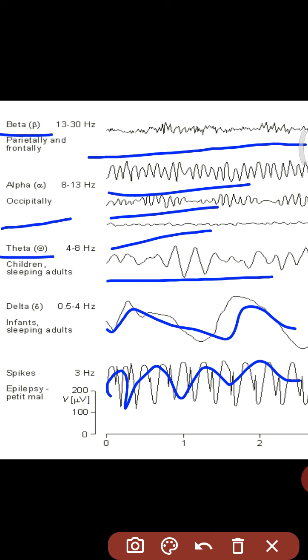Now we have spikes and waves of abnormal shapes occurring during attacks of epilepsy. The excitation or damping of electrical activity in the cortex can be due to a tumor, as a tumor presses on the neurons as well as destroys them. Oxygen deficiency due to circulatory disturbance, similar to bleeding, is another important cause. Similarly, earlier damage present in the cortex in the form of a tumor may generate abnormal electrical activity.